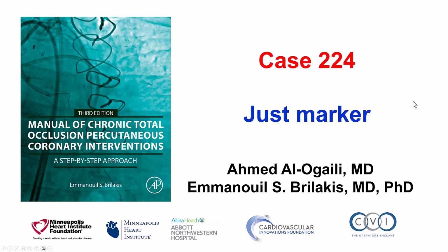Hi, this is Ahmed Alogaili and Manos Brilakis presenting case 224 for the manual of CTO interventions. This is a case illustrating the just marker technique for retrograde CTO crossing.